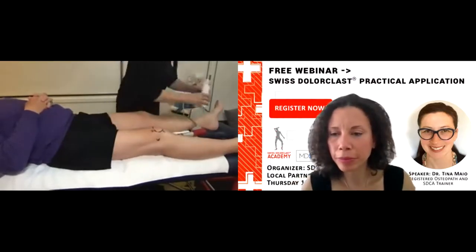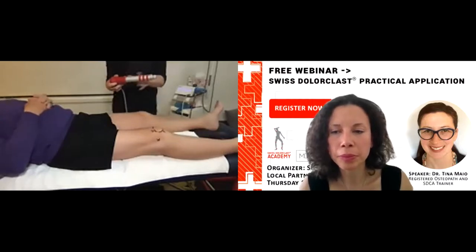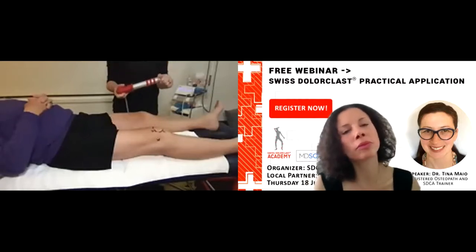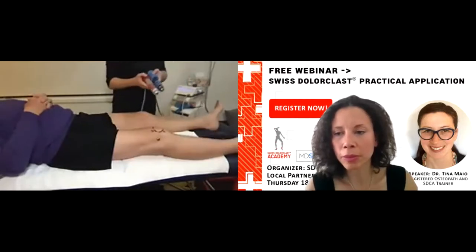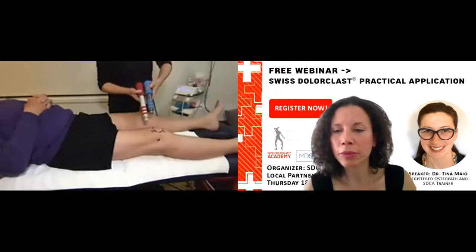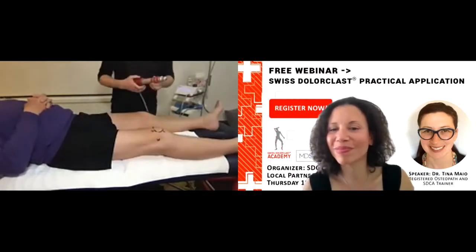So this is the power handle for those who haven't seen it. And compared to the Evo, it has a longer barrel here. So it's obviously the bullet that travels further, so it can actually emit a stronger shock wave. That's probably the biggest difference in the two. They don't look that different, but if you compare them side by side, you can see the red one's longer. I call this one the Ferrari because it goes faster. So we're going to apply this first.